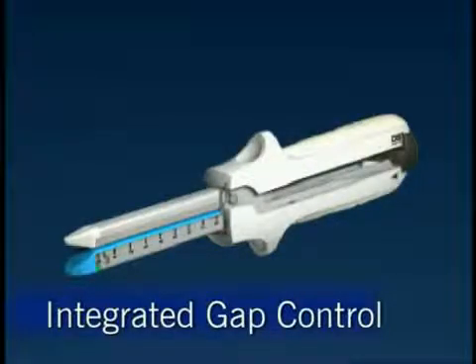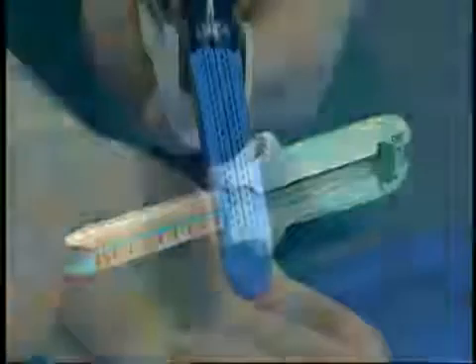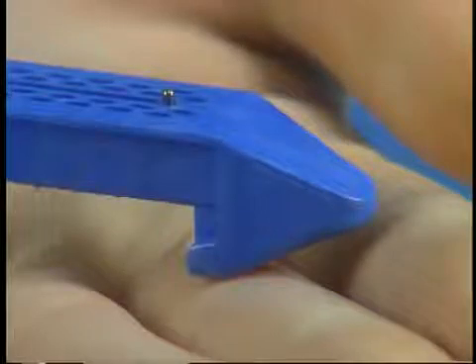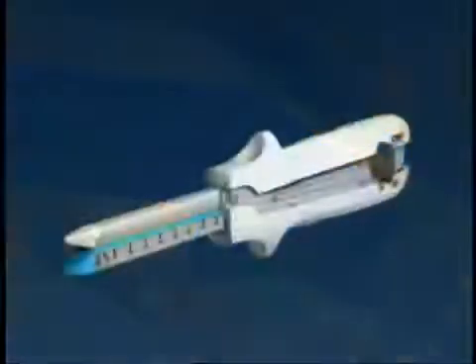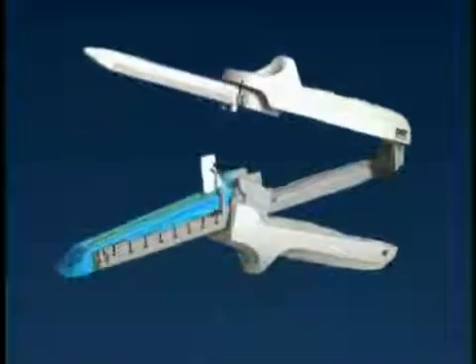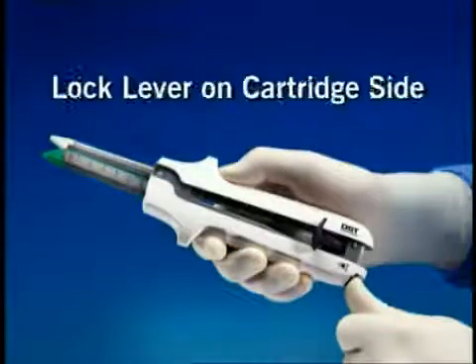Directional Stapling Technology's rectangular shaped staple and increased target area combine to provide more consistent and reliable staple formation. The integrated gap control feature of the DST series GIA staplers provides maximum cartridge and anvil fork alignment, consistent staple formation, and smooth firing force. It also allows for pinless atraumatic placement of the stapler jaws. The alignment pin found in older generation staplers can be traumatic to tissue.